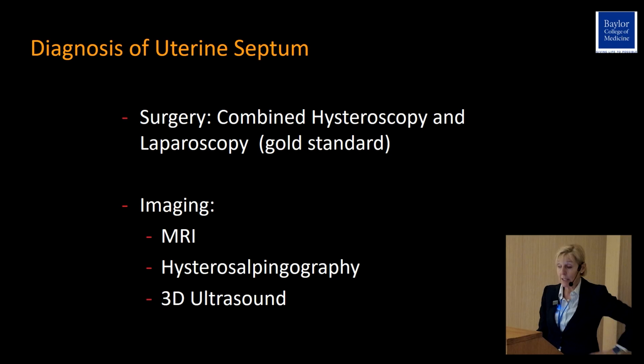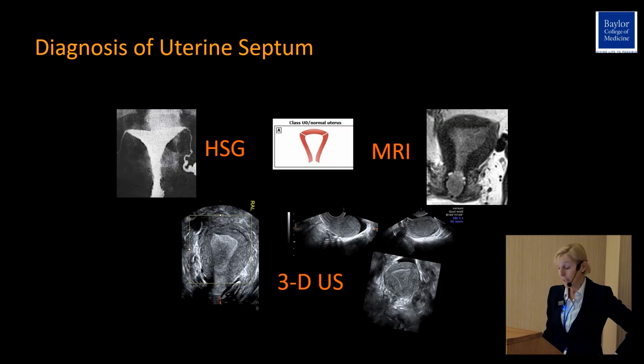Palumbo saying that before. And with imaging, we have different options. So we have MRI, hysterosalpingography, 3D ultrasound. I still find, in the US at least, that they use hysterosalpingography to diagnose the septum, and I just grinch at them.